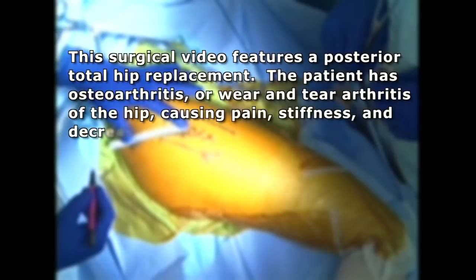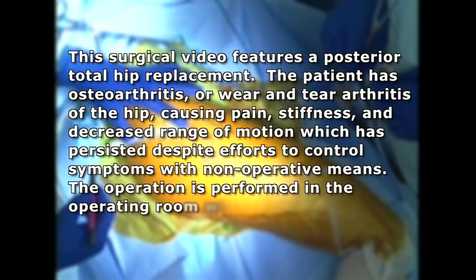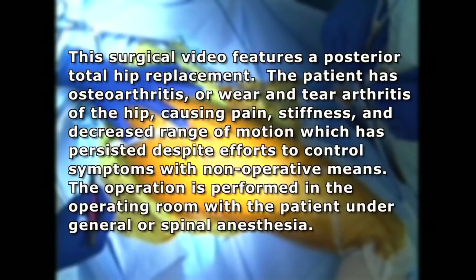This surgical video features a posterior total hip replacement. This patient has osteoarthritis, or wear and tear arthritis of the hip, causing pain, stiffness, and decreased range of motion, which has persisted despite efforts to control symptoms with non-operative means.